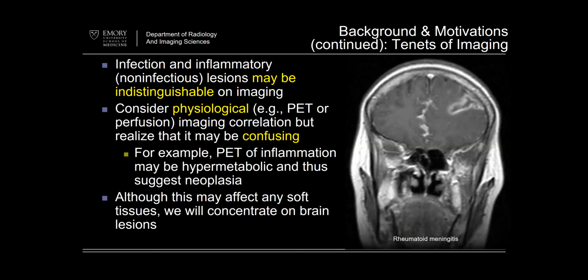A long time ago, I remember seeing a PET scan for somebody who had combined increased signal and decreased signal. And that's one thing that makes me think about infection, for example. But you don't always have that mixture, and inflammatory processes can be very concerning looking on advanced neuroimaging or nuclear medicine scan.